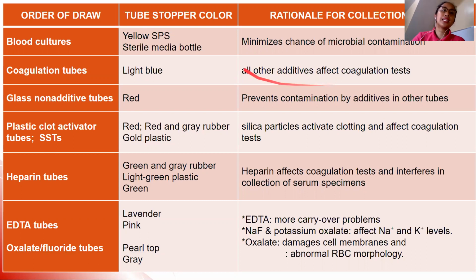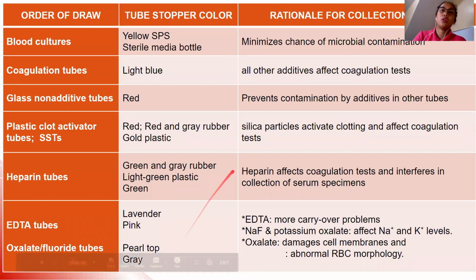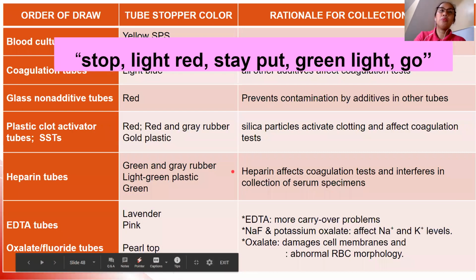Yan. Next is glass non-additive tube. So usually red. Tapos kung may yung may gel SST ka, yan. Yung may serum separator gel ka. Next, tapos heparin and EDTA tubes, oxalate, then fluoride tubes. Yan. Stop, light red, stay put, green light, go.